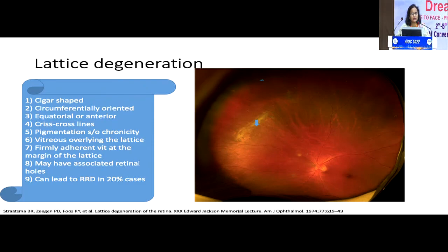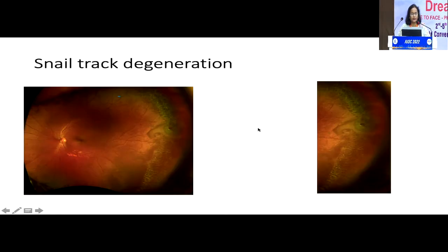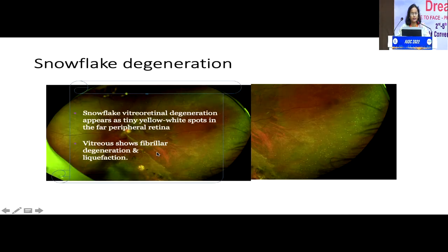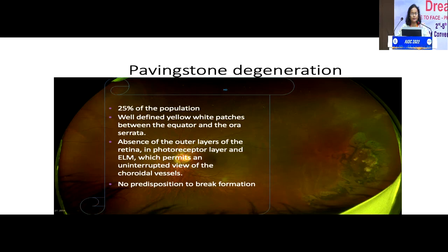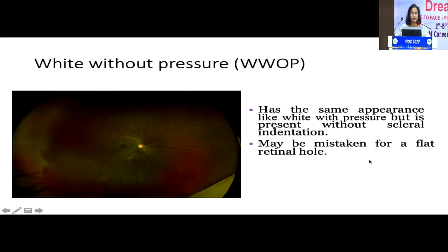This is an example of lattice degeneration in the superonasal quadrant of the left eye. This is snail track degeneration in the temporal quadrant of the left eye. The whitish-yellowish spots in the temporal periphery are indicative of snowflake degeneration. This is an atrophic retinal hole in the inferotemporal quadrant — no active vitreoretinal traction, so we label it as an atrophic retinal hole. The yellowish-white patches with pigmentation are indicative of paving stone degeneration.